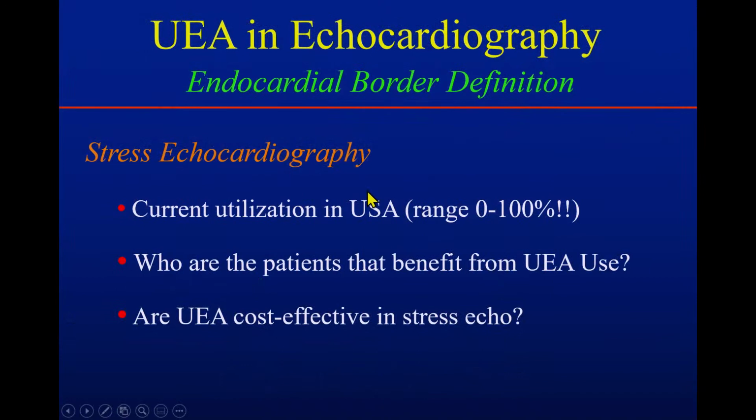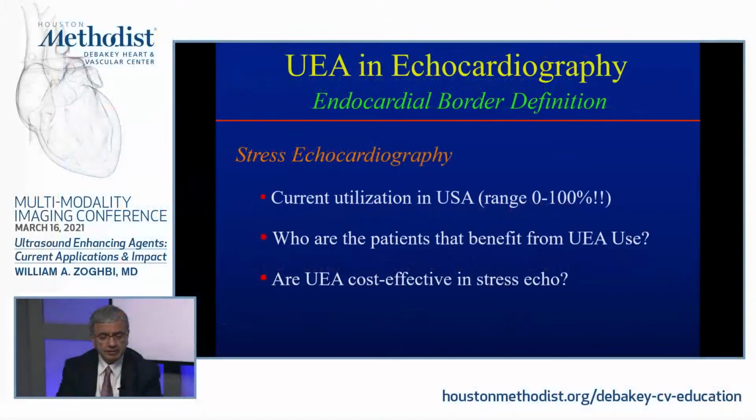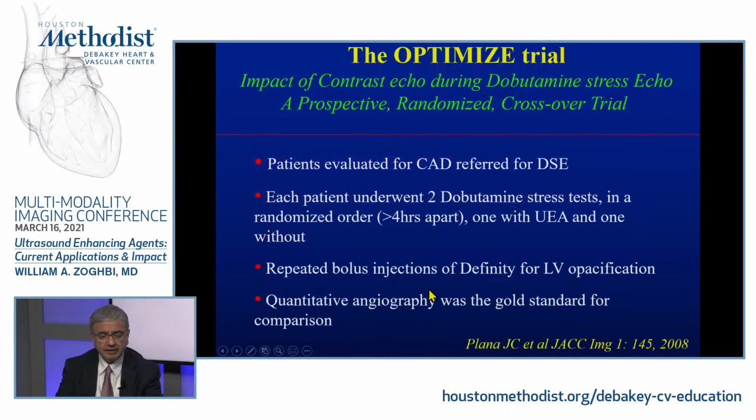Now, current utilization. I made this slide many years ago, and it's still basically this, but we have many more laboratories nowadays using ultrasound enhancing agents for use during stress echocardiography. Who are the patients who benefit, and are they cost effective? I think these are important.